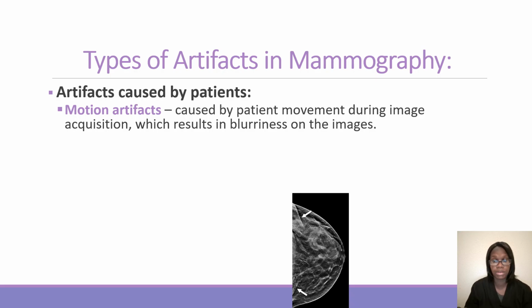Let's say they've had a mammogram 20, 30 times and they know how it's going to go, every tech is different. Whenever I trained with different techs, one tech told the patient to hold their breath at the very end, and then I had techs who tell patients to hold their breath twice. So it all depends on how you were trained by different techs.